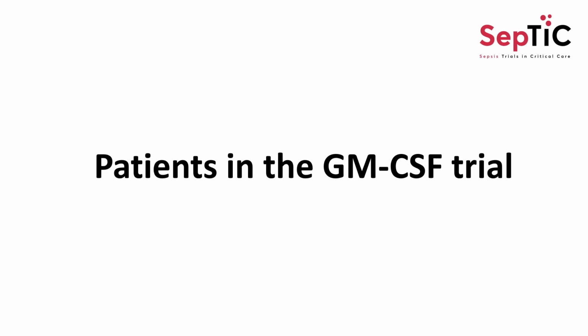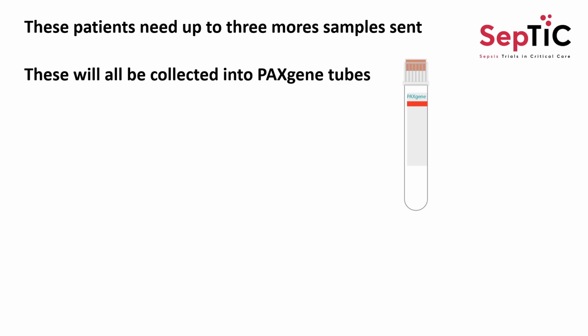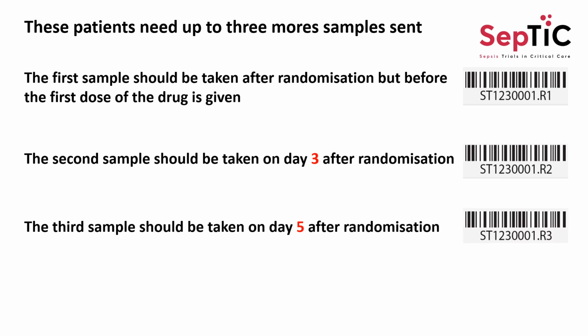If your patient is randomised into the GM-CSF domain of the trial, they will need some additional samples collecting. Up to 3 more samples will need to be sent, and these will all be collected into PaxGene tubes, which will have been sent separately to your initial sample collection pack. The first sample should be taken after randomisation but before the first dose of the drug is given, and this needs to be labelled with the barcoded sticker that ends R1. The second sample will be taken on day 3 after randomisation and will be labelled as R2, and the final sample is taken on day 5 after randomisation and is labelled as R3.